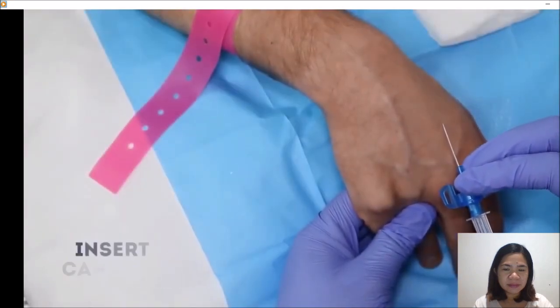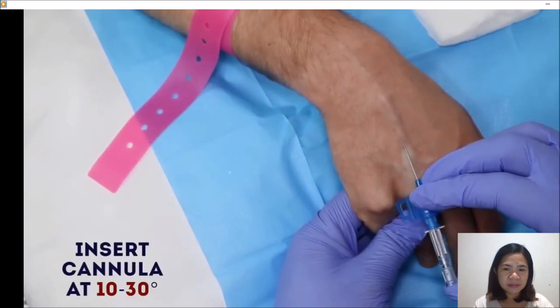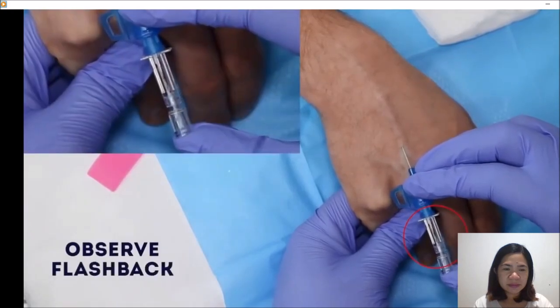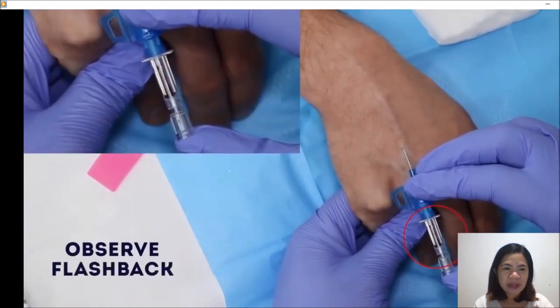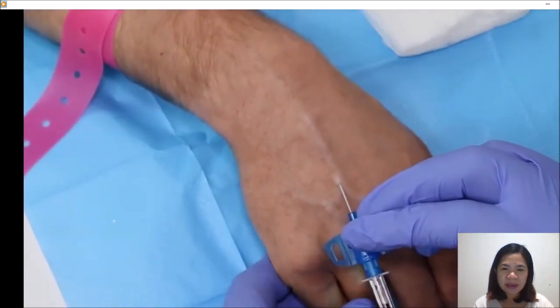Okay, James, sharp scratch. So that's the backflow, which tells us that we are on the right side.